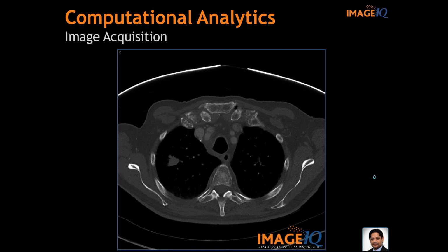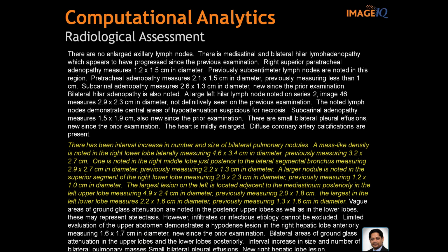But most reports look like this, and a lot of study coordinators are going through our reports and pulling out the dimensions, and things get lost. Am I looking at the right lesion if they didn't give a table position or a slice number? I've also seen study coordinators get confused on craniocaudal dimension. They'll list that one because that's the longest in some tumors, but for that particular trial, maybe they didn't want craniocaudal. So things can happen with these prose dictations in clinical trials that you don't necessarily want.